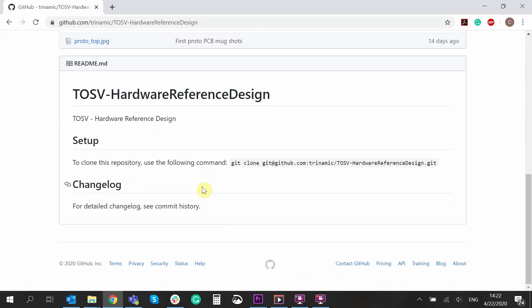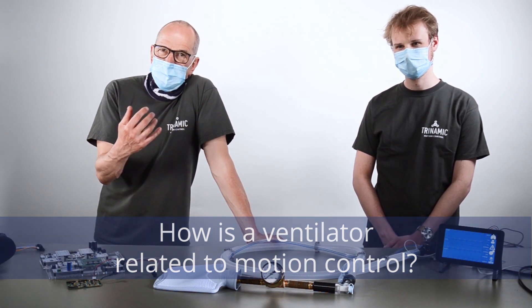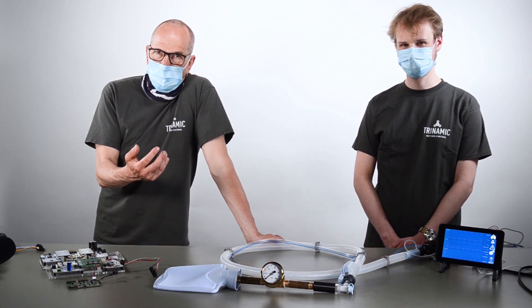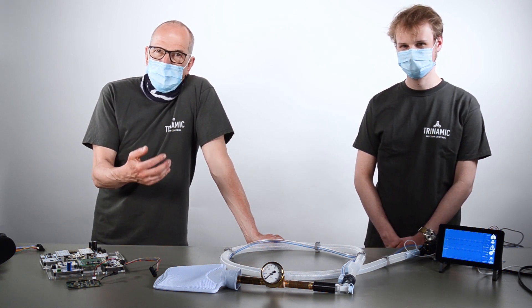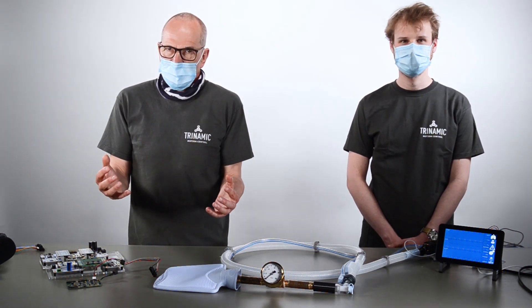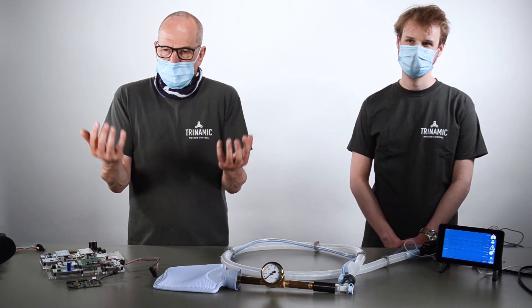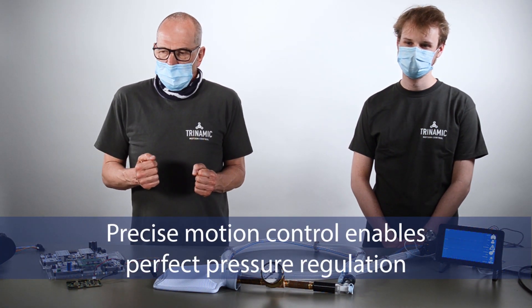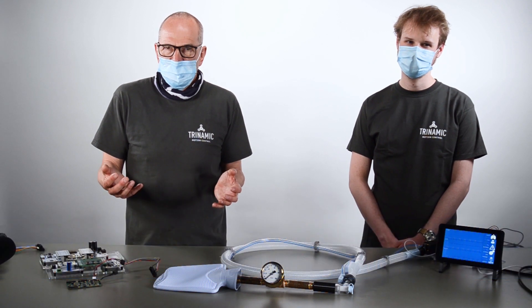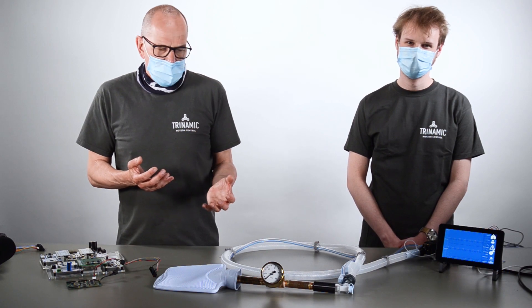Just like perfect current control is the secret for motor control, perfect pressure and flow control is the secret of a ventilator. The key for us — and this is where we are experts — is in perfect control, in ramping, in precisely controlling motion. So it was pretty easy for us to also come up with a solution for perfect pressure and flow control.